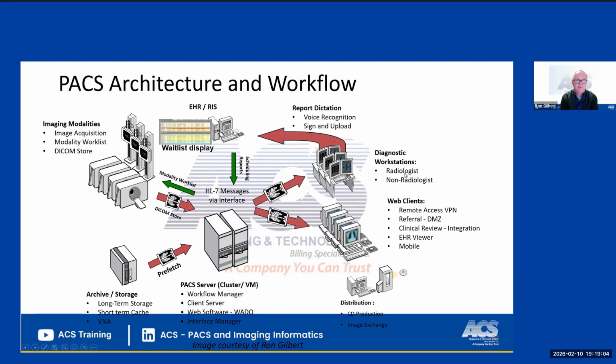Then the radiologist will do the reports on a digital dictation system where you speak into it and it turns into text. They will sign it. The final report will go back to PACS and also the electronic health record. And then you're able to distribute that image. You're able to make that image available to other healthcare facilities that patient may go to in their lifetime.